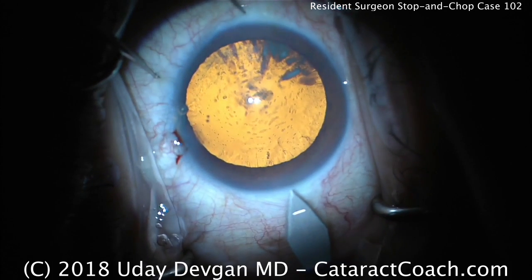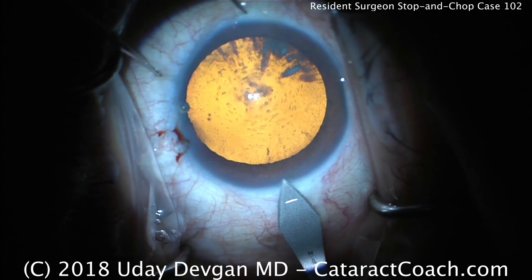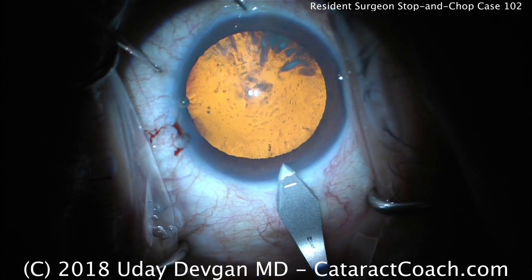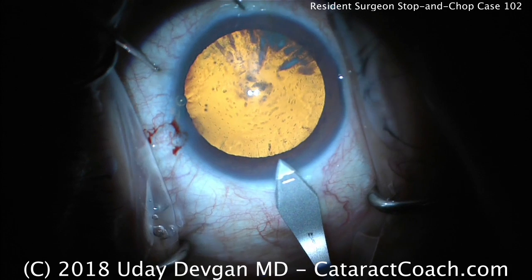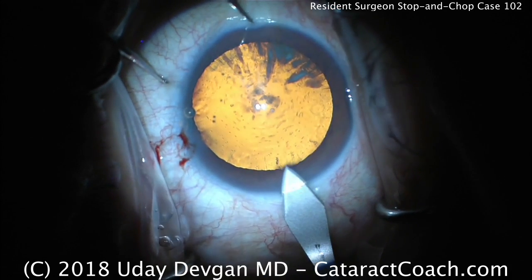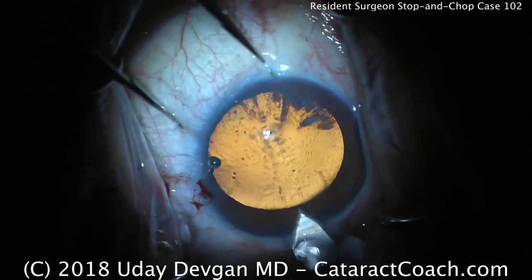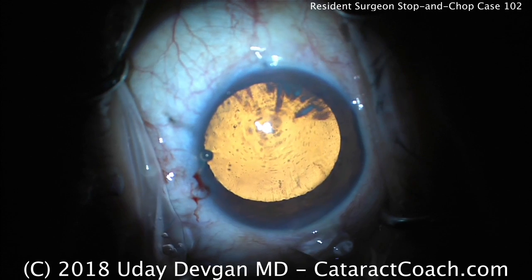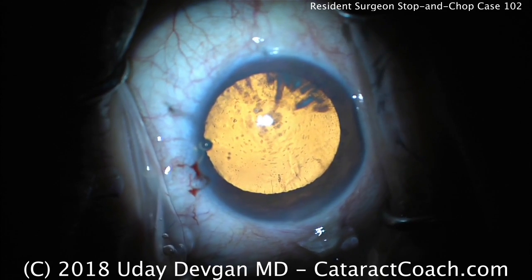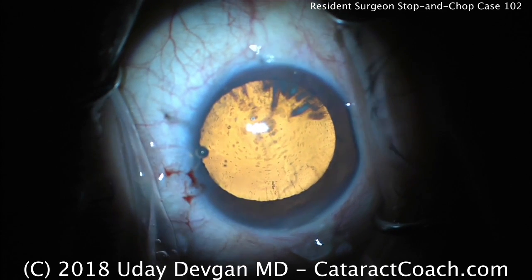Here's the main incision. Fixating the eye with forceps, here's the keratome and our temporal incision — hitting epithelium there, advancing through the stroma. Tunnel length looks just great. Entering the anterior chamber right about now; there's Descemet's layer. You can see how much viscoelastic came out of the eye — very typical for a cohesive. That was a very nice incision that will seal well and provide an appropriate amount of maneuverability inside the eye.